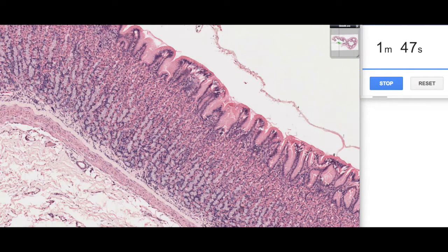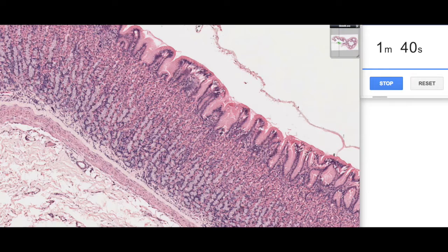Whereas the basal part of these glands is more basophilic, or more purpley-blue stained, and that's because of the higher concentration of chief cells which are found in the base of the gastric glands.